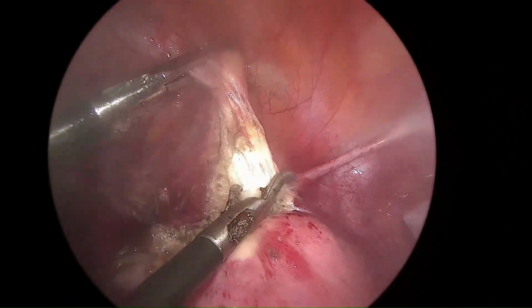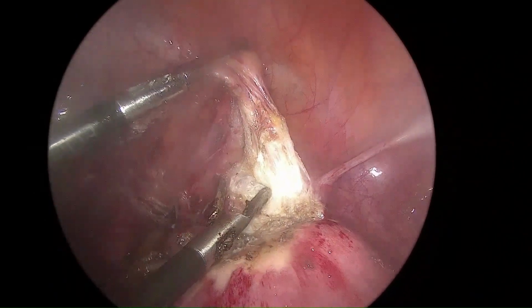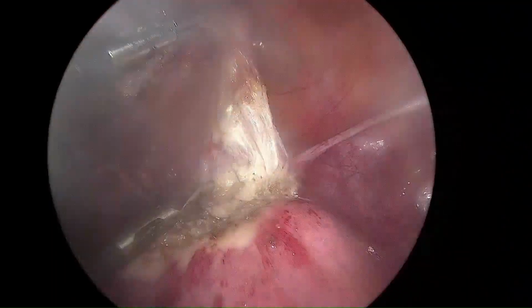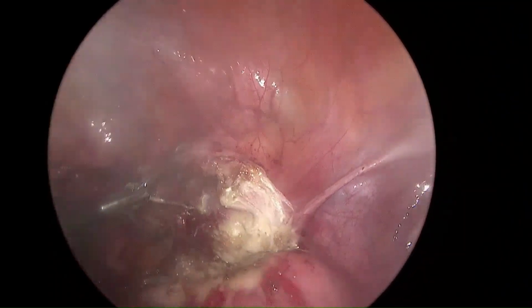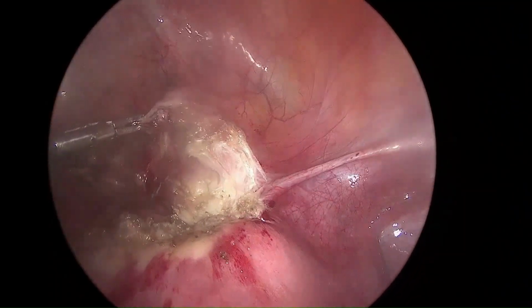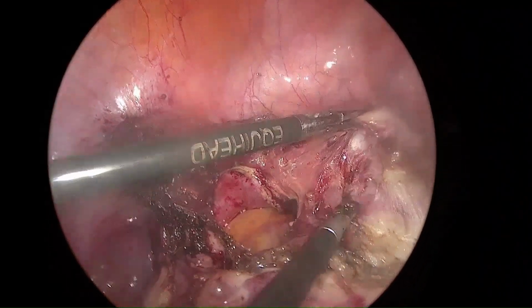While cutting the scar, make sure you cut the scar more onto the uterus and not onto the bladder. Giving traction on the bladder to delineate the scar completely is very important while cutting on the scar area.